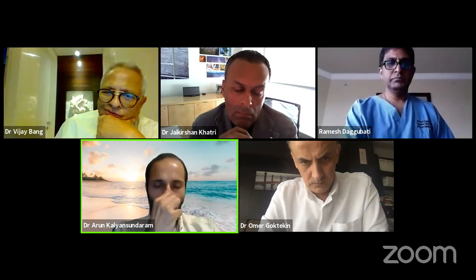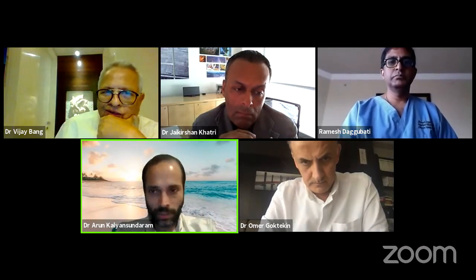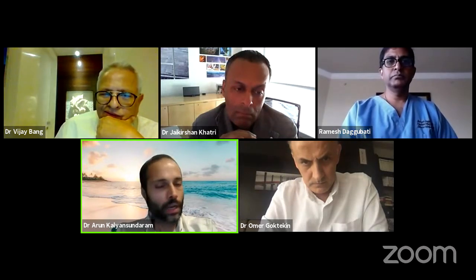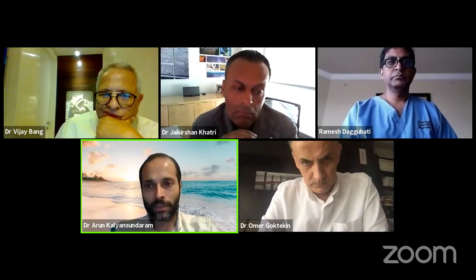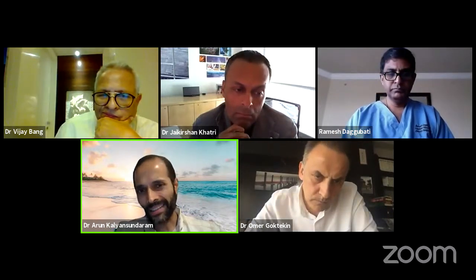So, just to answer this, I routinely straw, every time. Once the balloon is there, while I'm waiting to position it, I at least aspirate through the Stingray catheter, just because while I'm waiting, you're still having inflow. So why not avoid it? I routinely do that, number one. Number two, let us say it doesn't work.